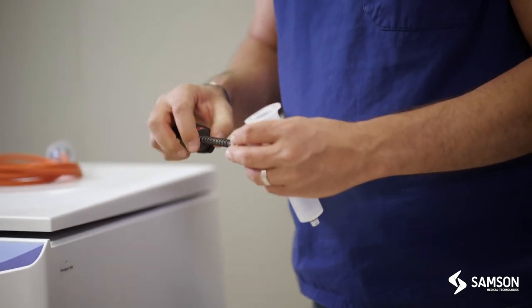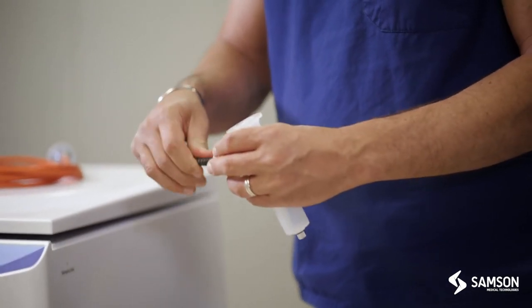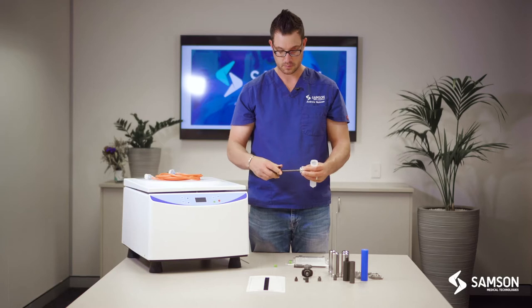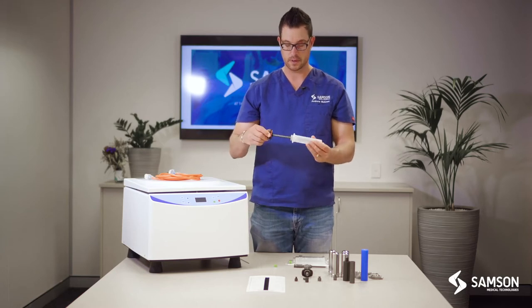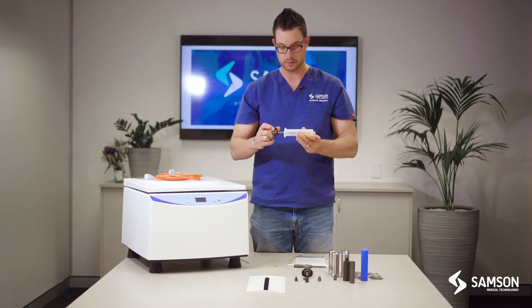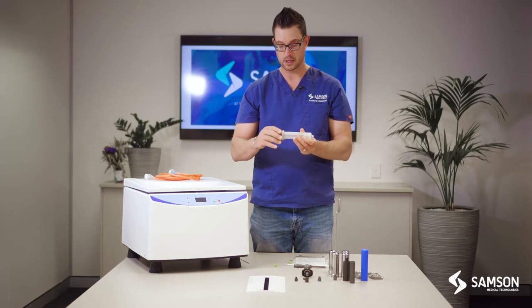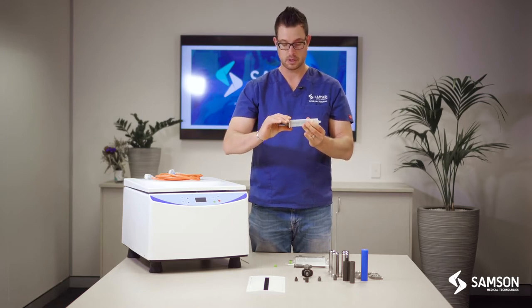That is then connected to the back of the piston and then it is placed in the syringe. It's pushed all the way down and then it is twisted and locked.